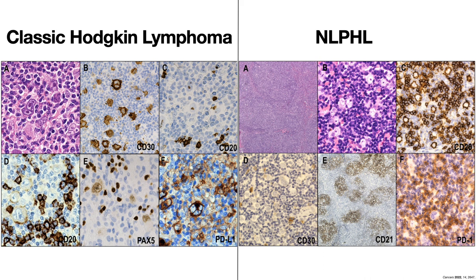In figure B, the Hodgkin Reed-Sternberg cells are universally positive for CD30. In figure C, they are negative or weakly positive for CD20, because in classic Hodgkin lymphoma the B cell program is hijacked by the neoplastic cells and is not intact. In figure E, Hodgkin Reed-Sternberg cells show the signature weak PAX-5 staining.